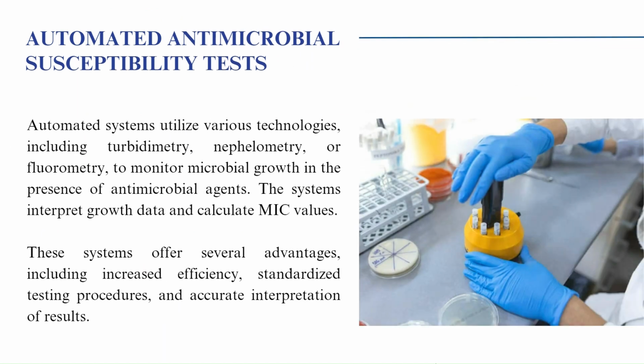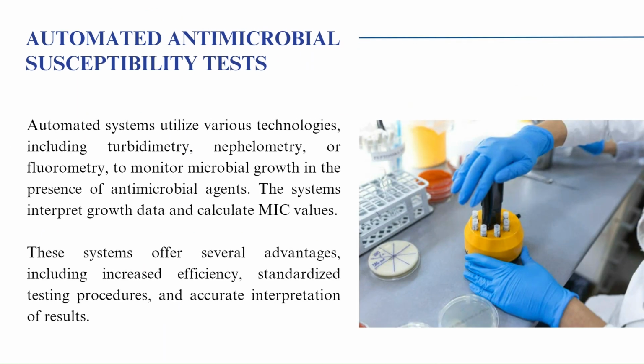Automated antimicrobial susceptibility tests. Automated systems utilize various technologies, including turbidimetry, nephelometry, or fluorometry, to monitor microbial growth in the presence of antimicrobial agents. The systems interpret growth data and calculate MIC values. These systems offer several advantages, including increased efficiency, standardized testing procedures, and accurate interpretation of results.